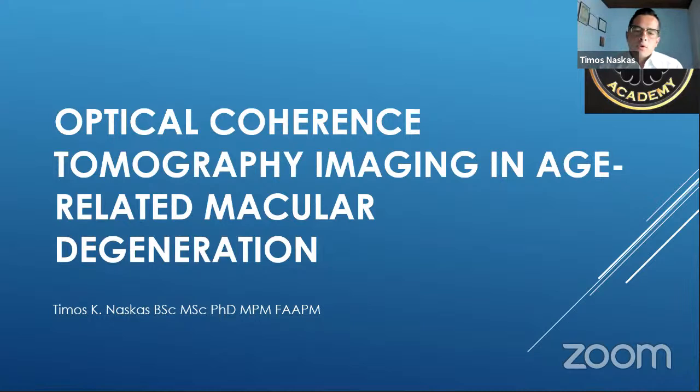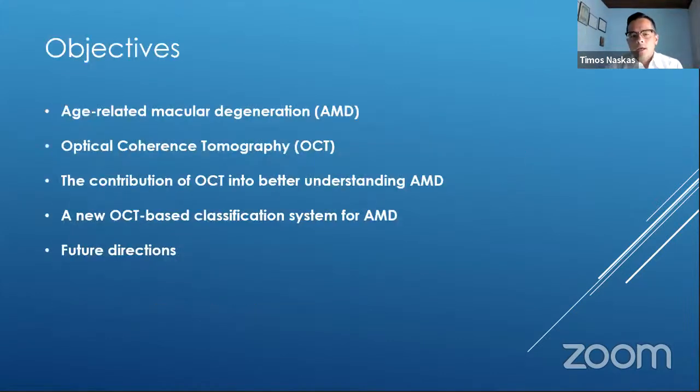Thank you. So what we will be discussing today is the use of the OCT imaging technique in AMD. We will start by briefly discussing AMD, its causes, as well as its risk factors. I will not go much into the molecular pathways that lead to the disease and the pathogenesis models. So this will be mostly a brief description of the causes that lead to the development of the disease.